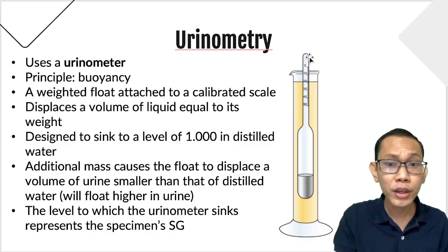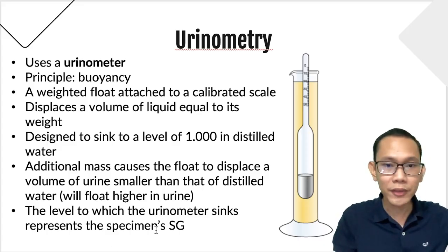That's the basic principle of the urinometer. The level to which the urinometer sinks represents the specimen's specific gravity.